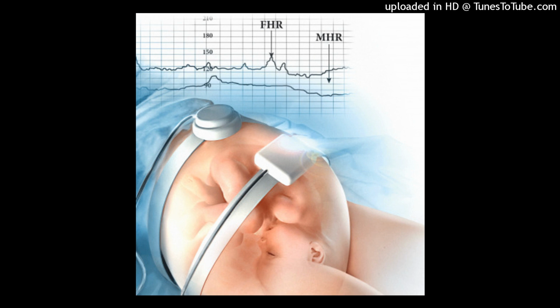Fetal monitoring tracing. Fetal monitors capture FHR and UA data, which prints on a continuous paper tracing similar to an electrocardiogram strip. Some institutions prefer data be recorded on a computer tracing that is viewed at the bedside or a remote location instead of paper. Regardless of the mode, each tracing has an x-axis and y-axis with an upper and lower graph, figure 14.8. FHR information is traced on the upper graph and UA is recorded on the lower graph.